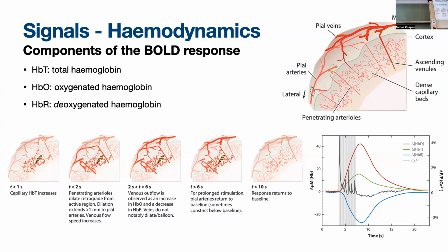What we do mostly is this BOLD response focused on hemoglobin, originating from this change in hemoglobin oxygenation. So that's what we'll talk about mostly for the remainder of the course. When someone says fMRI, they will generally mean BOLD-dependent fMRI, but there are others.